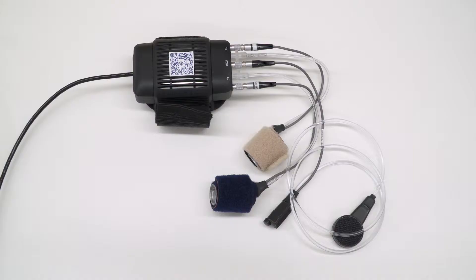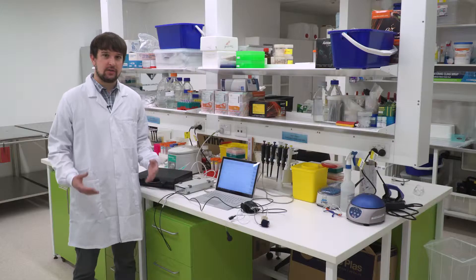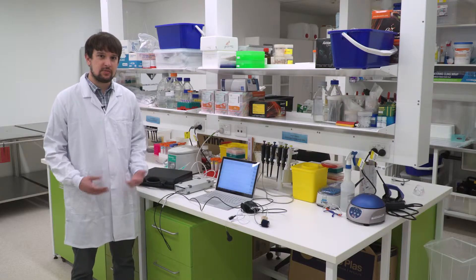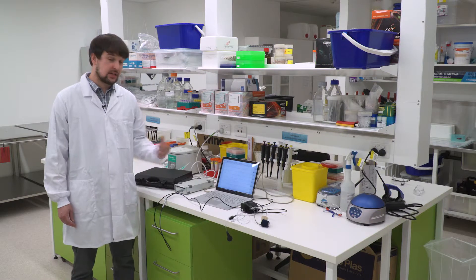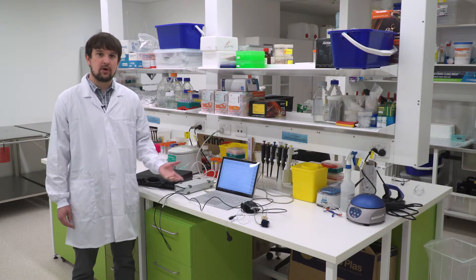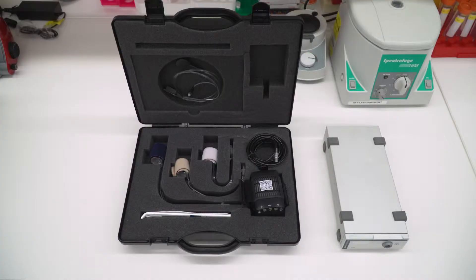I'm here today with our human NIBP nano system, which is a non-invasive blood pressure measurement system designed for use on humans. It's a successor to an existing product we have called the human NIBP system.